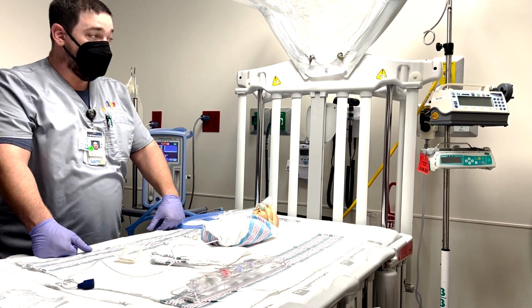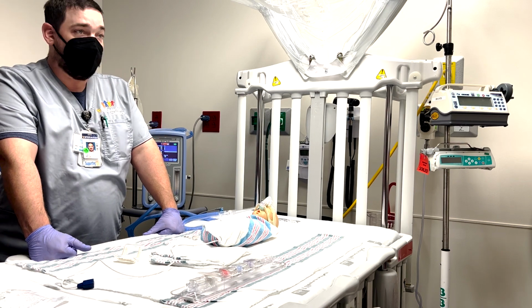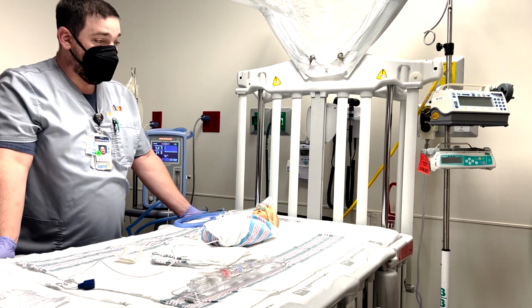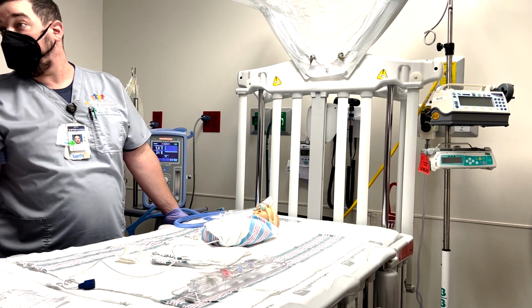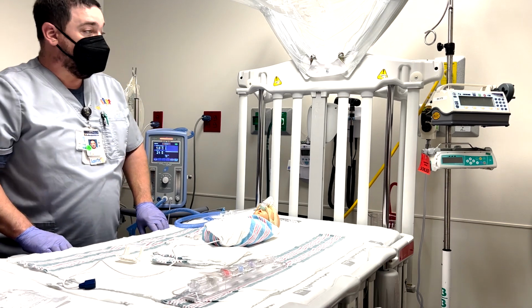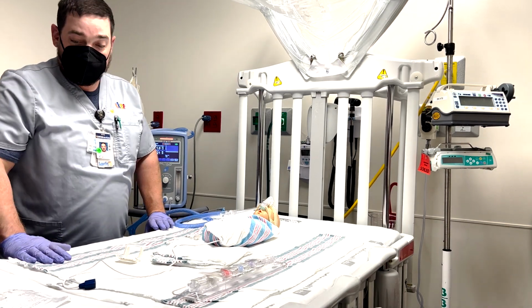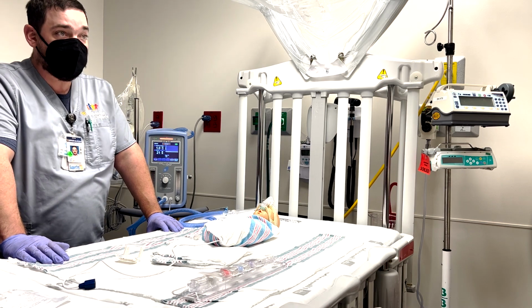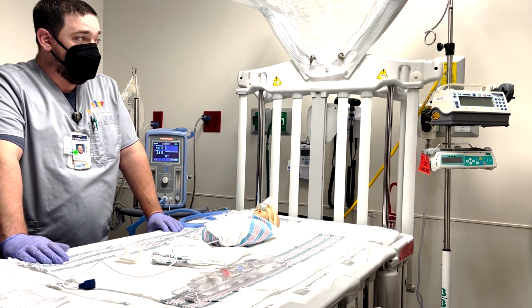But again, we're also doing skin breakdown checks every 3 hours, or should be, given that situation. And it hasn't failed me yet, knock on wood. But it was one of those tricks and habits that really got me to figure things out and say, okay, at least I'm looking. How can I alleviate this?